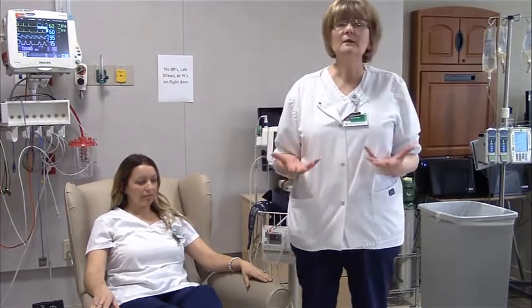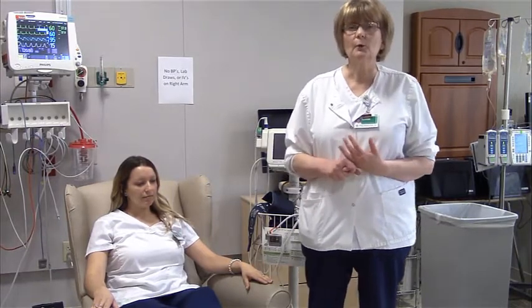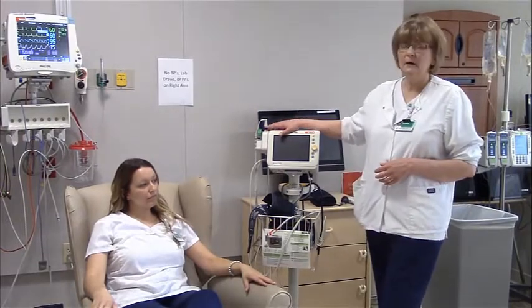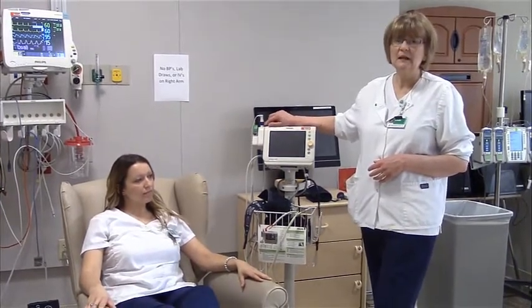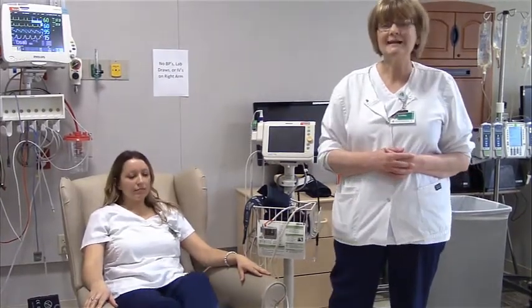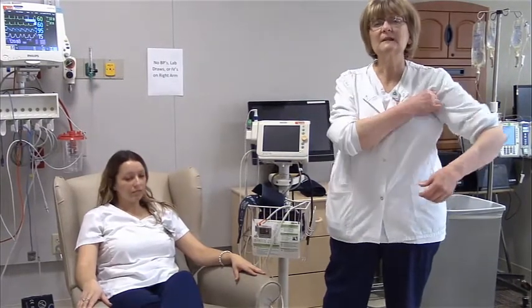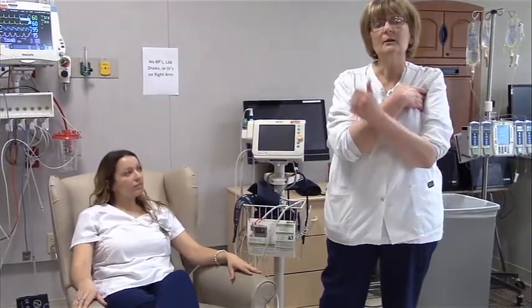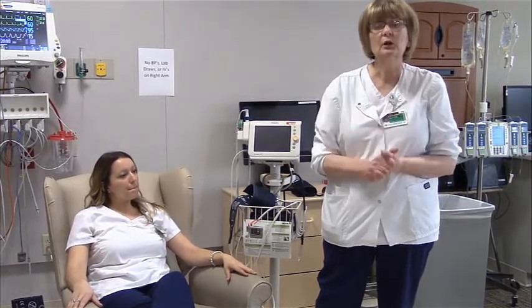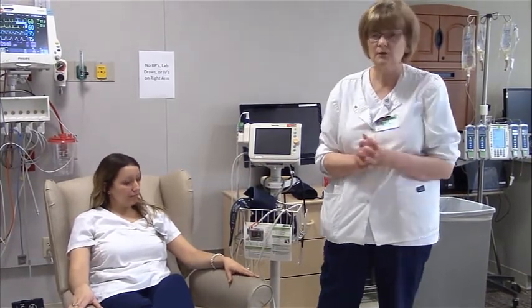First thing I want to talk about are temperatures. You have different methods in which to obtain a temperature. The normal one, of course, is an oral temperature. So you want to make sure that you have the temperature that has the blue probe indicating it is for an oral temperature. You may also use this for an axillary temperature. And an axillary temperature is where you're taking the probe, skin-to-skin contact under the arm, so that means moving the arm out of the way, placing it under, and it will record as an axillary temp. I will be demonstrating an oral temp shortly.